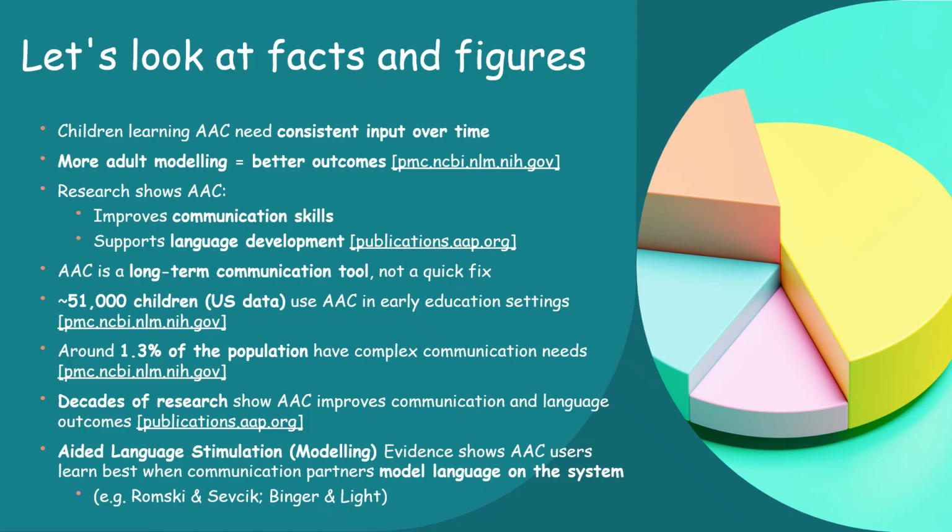the children. So when we think about supporting AAC users, our role as communication partners isn't just to provide the system, it's to actively show them how to use it throughout the day. We're actively modelling simple language. If the child wants to go to the toilet, we're going to model language around that. Every day, in every situation, we should be modelling this language, and the progress is that the child sees this and then will implement it themselves. So our job as adults around is very, very important.